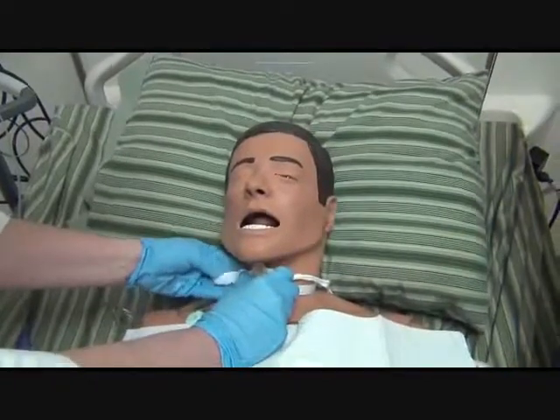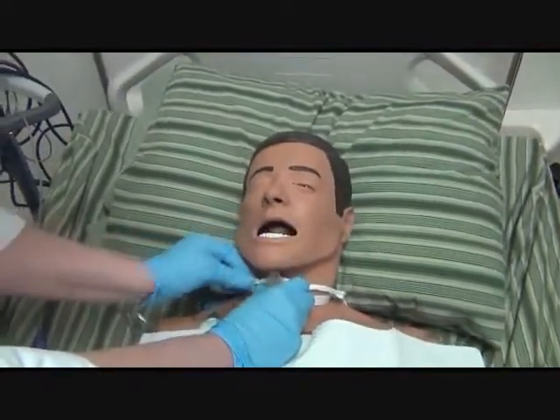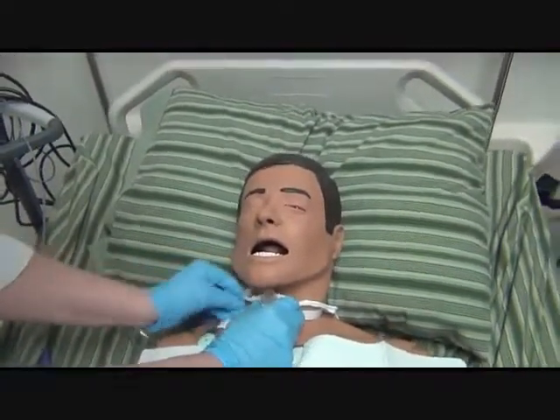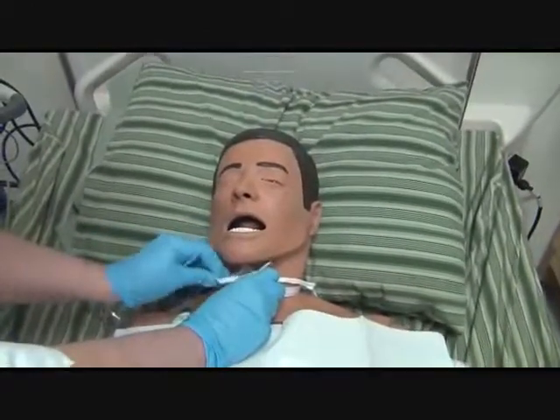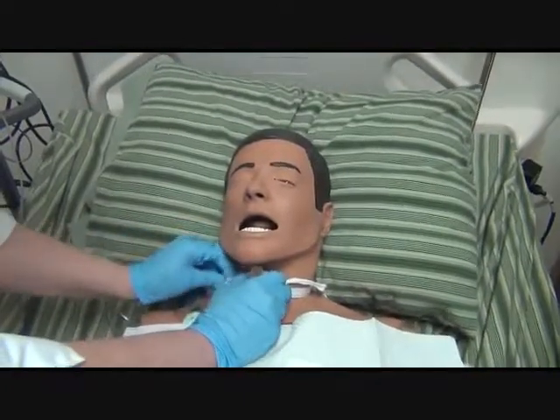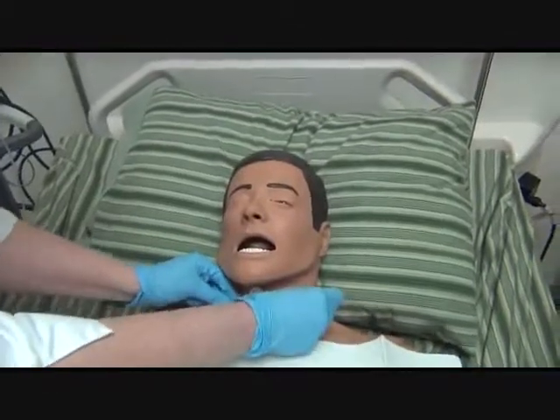I love my tweezers, so I'm kind of lost without them here. Cinch that up again, and we're going to make a third knot. Again, make sure it's good and tight. Again, check to make sure that you've just got that one finger breadth in there.